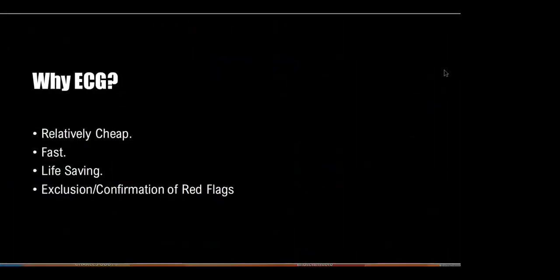So this is a recapitulation from the last time. Why do we need an ECG, or as other people call it, an EKG? The first point that we discussed last time is that it's relatively cheap, if you compare it to other diagnostics that you need to confirm or rule out different diagnoses. It's relatively cheap, it's faster, and it's life-saving.